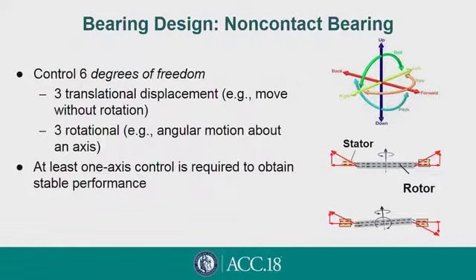Now, another important type of bearing design is a non-contact bearing, or bearingless design. And essentially here, the bearing is floating in blood. So there's no contact, there's no mechanical suspension to the bearing. And these are complex systems now, because the impeller has to be controlled in 6 degrees of freedom. So there are rotational movements around the X, Y, and Z axes, as well as translational movements, those movements which are not associated with rotation.